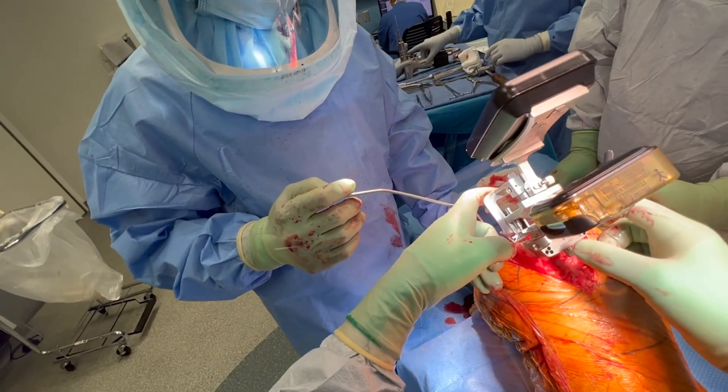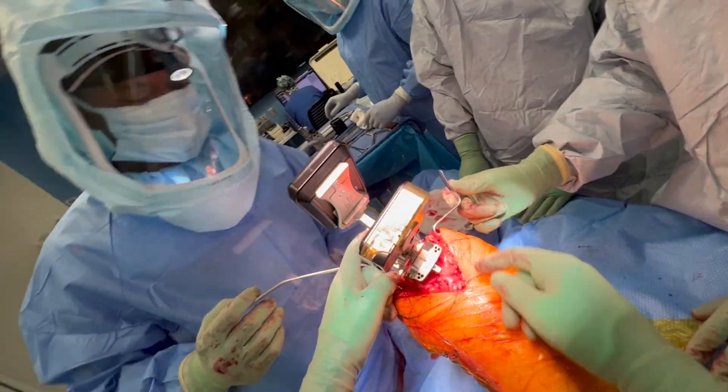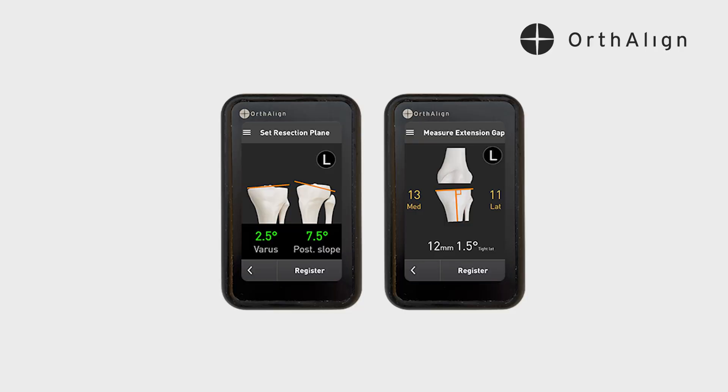I'm going to put the distal femoral resection guide onto the femur just to see where those paddles touch down on the distal femur. In this case she's a little bit looser on the medial side — 13 millimeters and 11 millimeters in that extension space. I want to cut two millimeters less of a distal medial cut to balance that extension space, but I also want it to be a full nine millimeters of a medial cut so that it maintains balance in both extension and flexion.